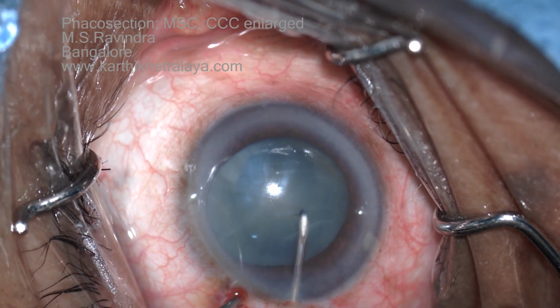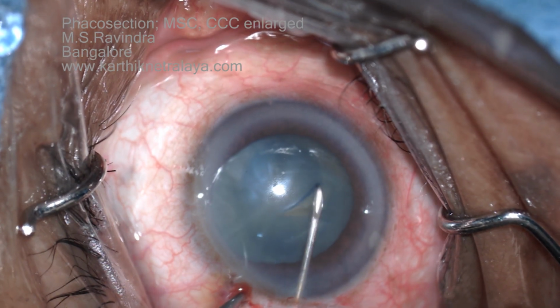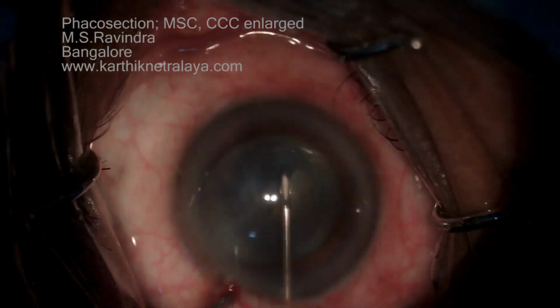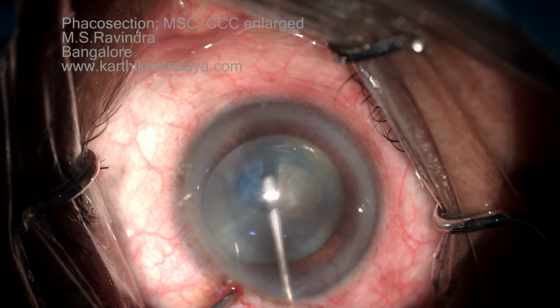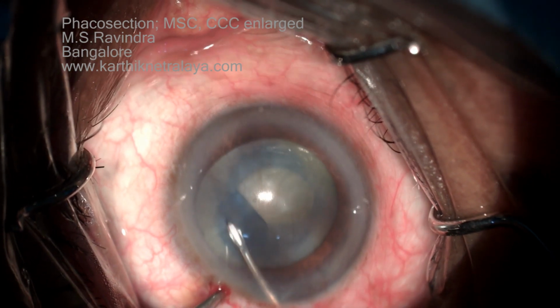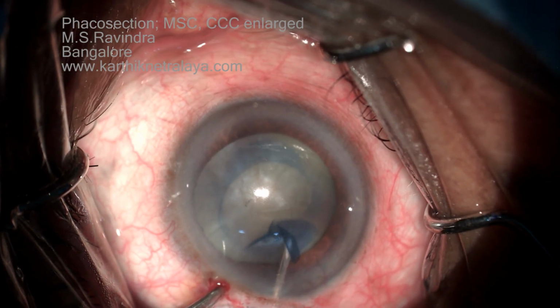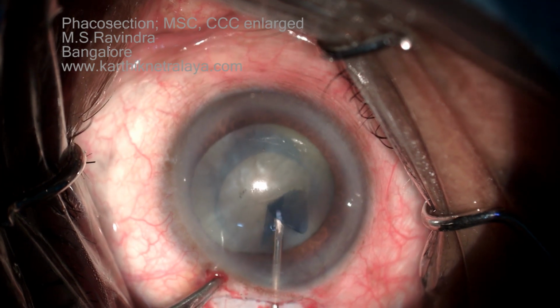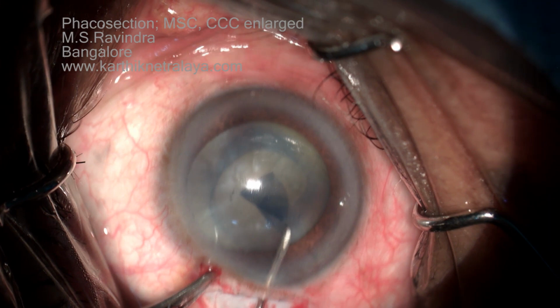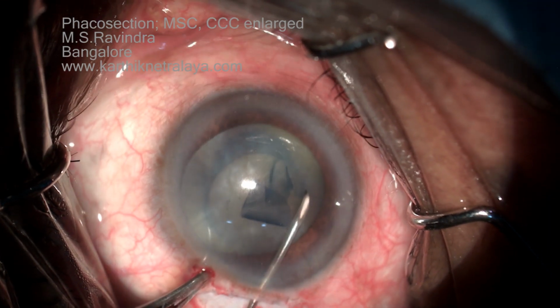The needle is entered through the tunnel floor, the technique that I adopt in all cases, which keeps the tunnel closed right now, with the anterior end of the tunnel lifted up by the pressure in the anterior chamber. There is no exit for the viscoelastic, so the chamber remains deep and the chance for the rexis to run off to the periphery is minimized.